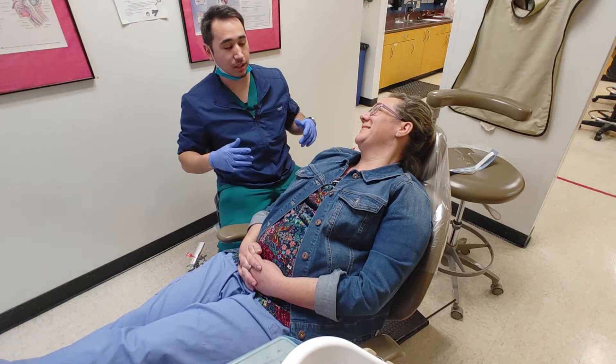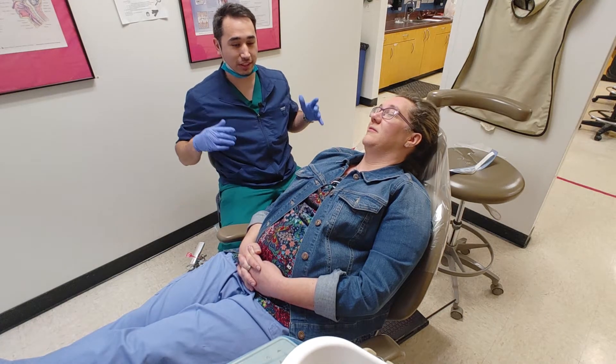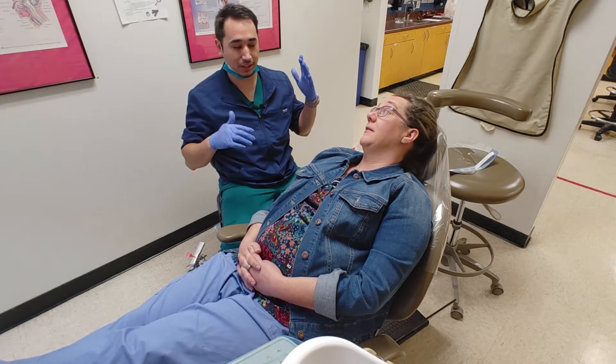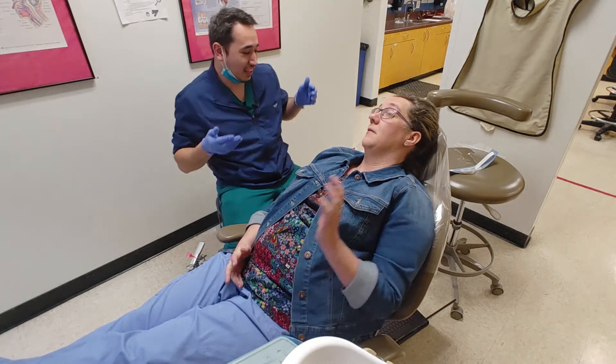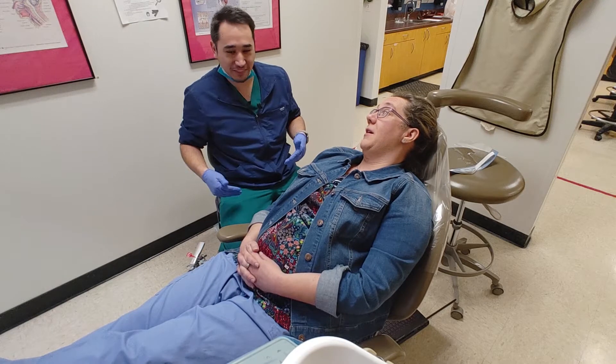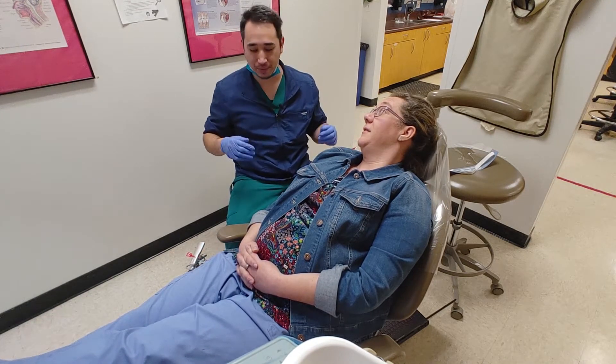Today we're going to be doing vitality testing on that tooth that's giving you a little bit of an issue. I want you to give me some type of signal to tell me to stop my test when I do it. That can be either you raising your hand, a yeesh or yikes, something to tell me to stop my test.